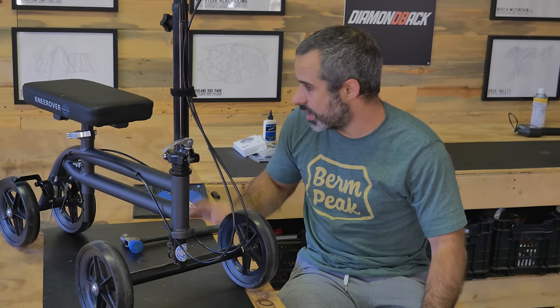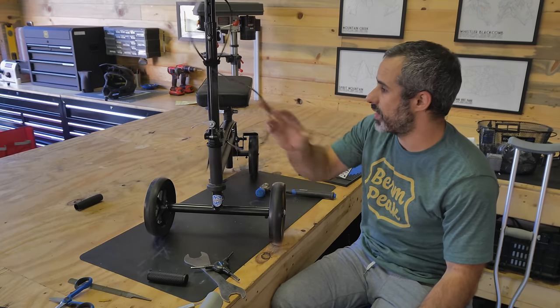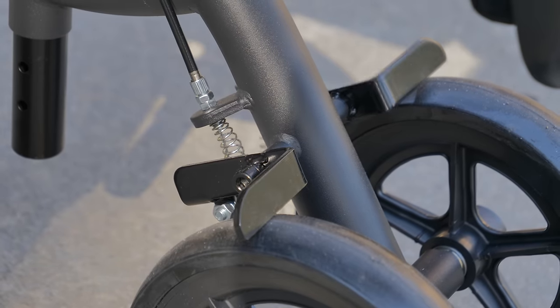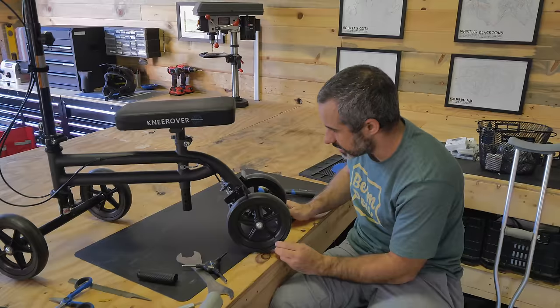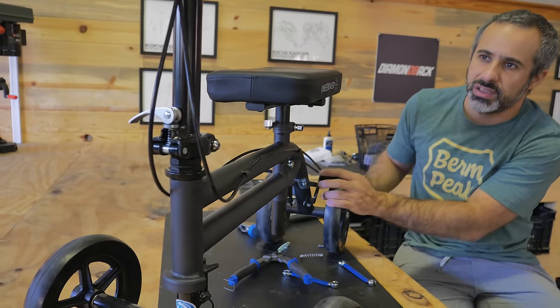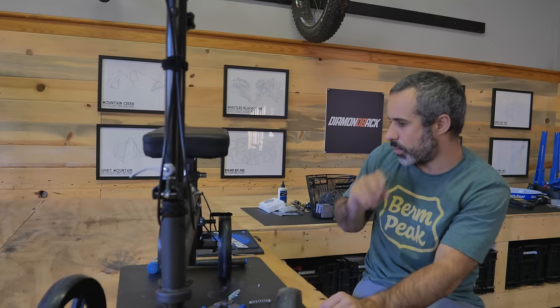Next up I want to shorten these cables — no reason for these cables to be flopping around everywhere. You can see it's got these mechanical brakes that push directly on the wheels to stop them from spinning. Pretty primitive but it's a knee scooter. Let's get these disconnected. We're just going to shorten these up so that there's just a little slack, not tons of it. Yeah that looks good, that's about where I want them.